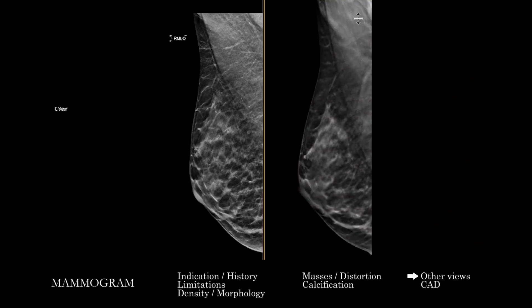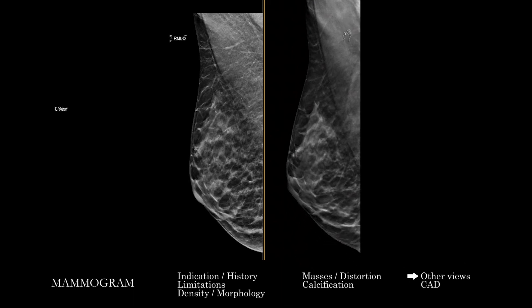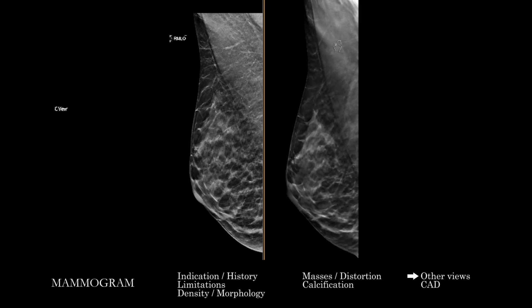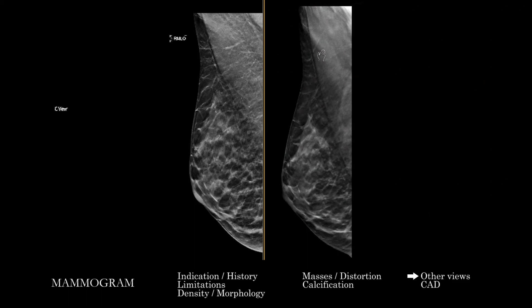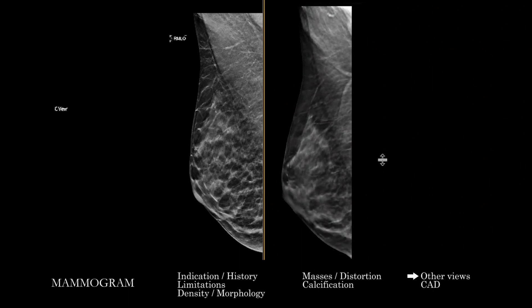If your institution uses tomosynthesis views — and this is increasingly used for benefits in sensitivity and specificity in picking up abnormalities — you can apply a similar search pattern or way of approaching this as you do for the 2D images. You can divide the breast into multiple areas and scroll back and forth through the depth of the breast tissue to make sure you cover the entirety of the breast anatomy.